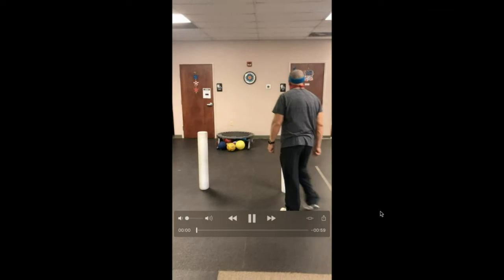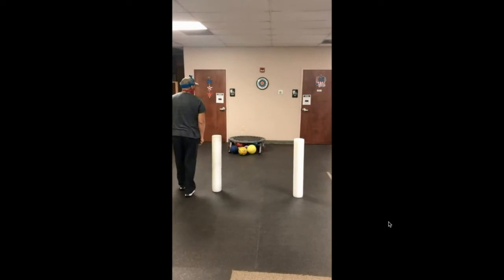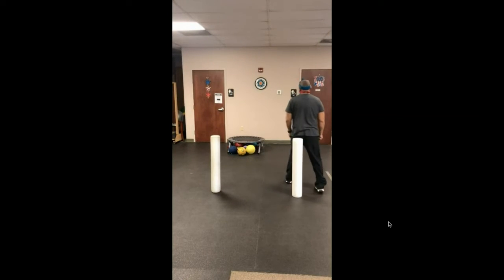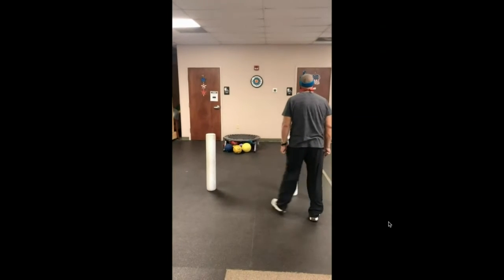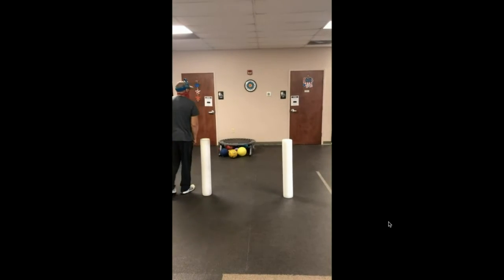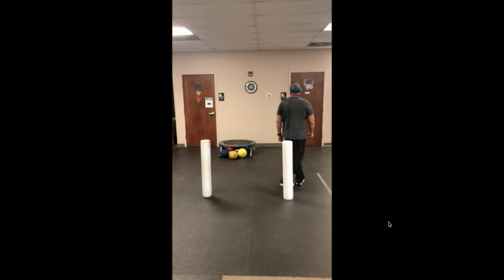So if we roll out this video and we just kind of watch it, they have a drop target on the clock. I use a motion guidance contact pad to stick behind it. And they are just walking around while keeping their visual field high. So you can see if they start to visually cheat pretty easily because the laser will drop down.